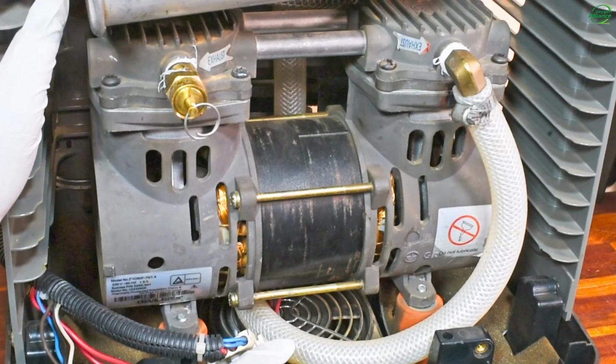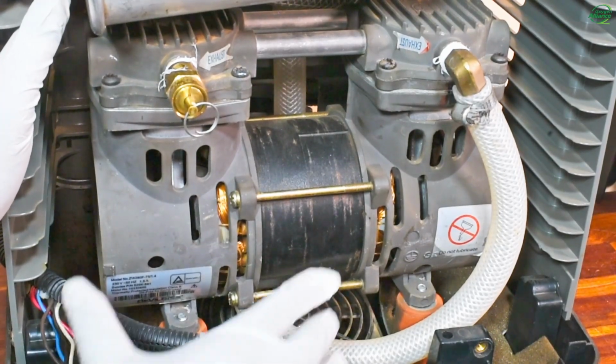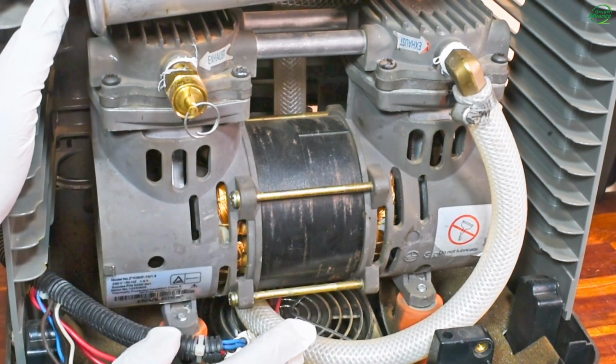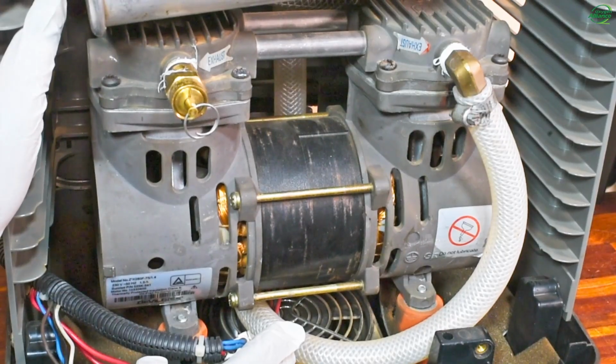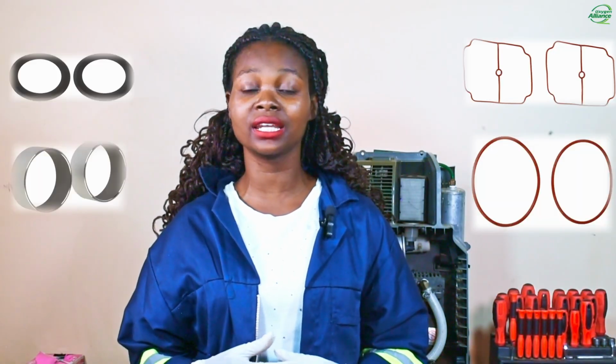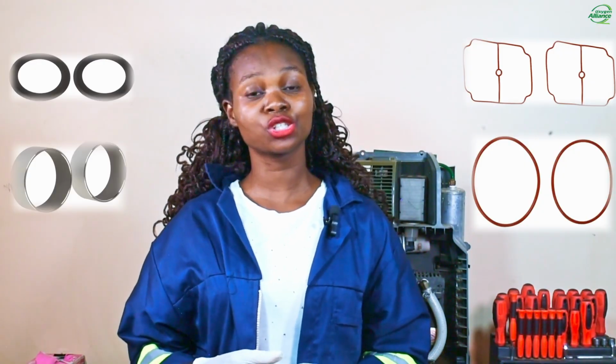In most cases, compressor failure is a result of a worn-out compressor kit, which includes cylinder sleeves, cylinder caps, gaskets, O-rings, and flapper or reed valves. Components such as O-rings, gaskets, cylinder sleeves, and caps maintain airtight seals and ensure efficient air compression.